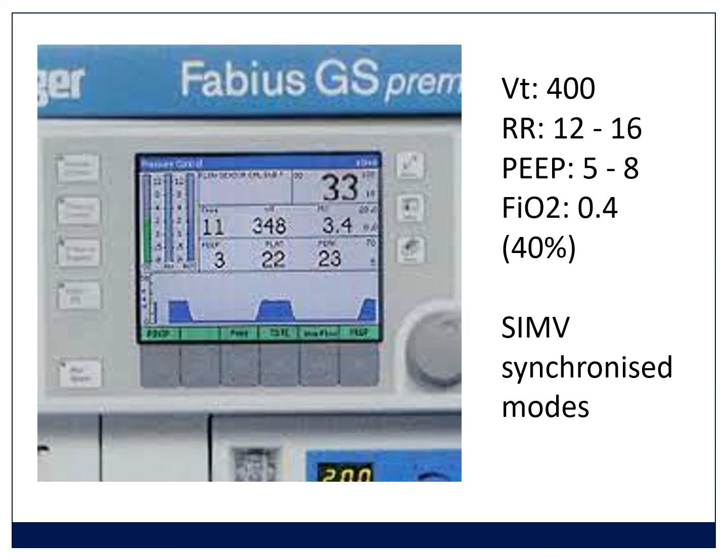Choose an SIMV mode. It's synchronized intermittent mandatory ventilation. The reason that I suggest that is that when the patient does start to breathe, the machine will support those breaths rather than a purely mandatory mode. And just remember that if you put on the ventilator and nothing is working, you're not delivering any air, but you're sure your tube is in, go back to manual ventilation. And if you can manually ventilate the patient, then you've got time. You continue to do that. You can even finish the case on manual ventilation, or you can try and initiate ventilation again.